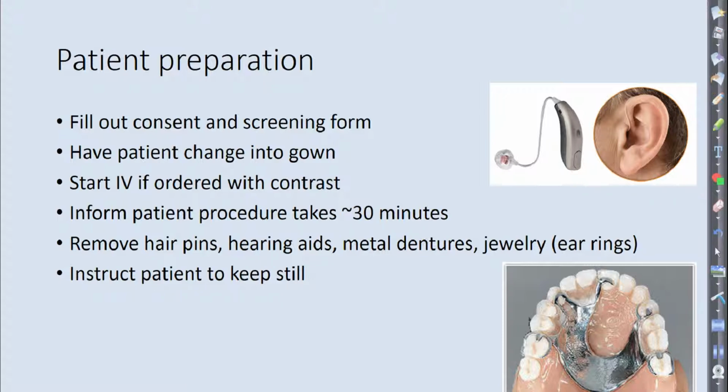They're not typically covered by insurance sometimes. So don't screw up their device because you were too lazy to ask them to remove it. Yeah, I've seen them remove it. They just kind of put it on the counter or whatever, and that's done. And they're in the room, but remember, they're outside that 5 gauss fringe field.